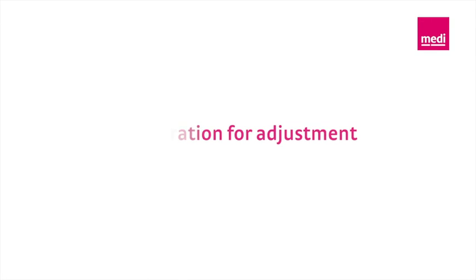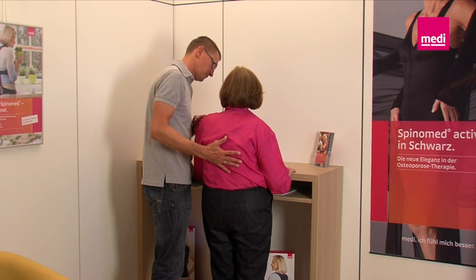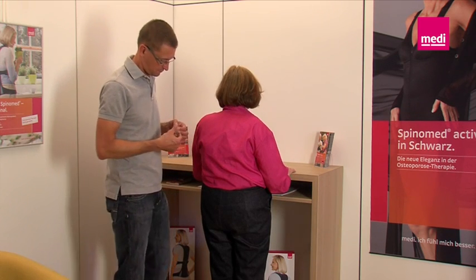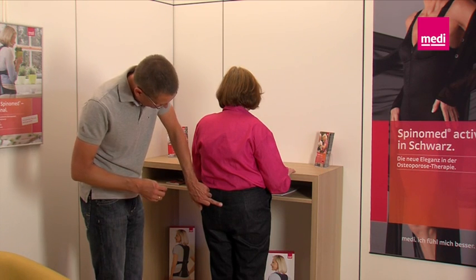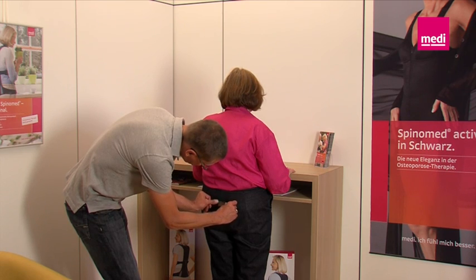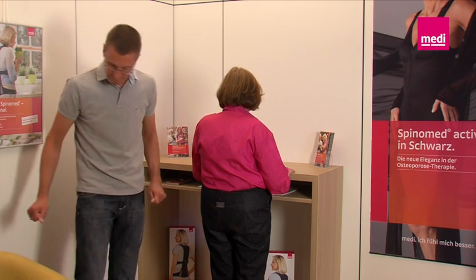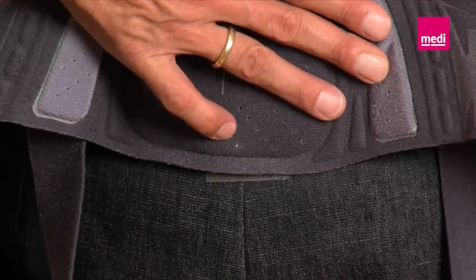Preparation for adjustment. Now comes the adjustment of the back rod. The patient should stand as upright as possible and should be able to make use of supports, for example a table. Simplify your work by marking the sacrum — this mark is your reference point for the entire adjustment of the back rod, and it represents the lower edge of the brace.